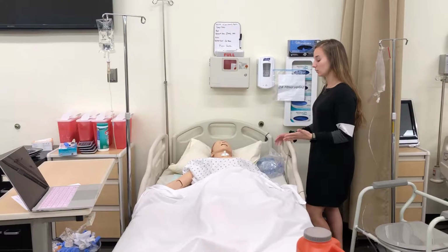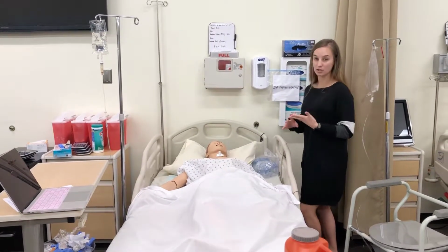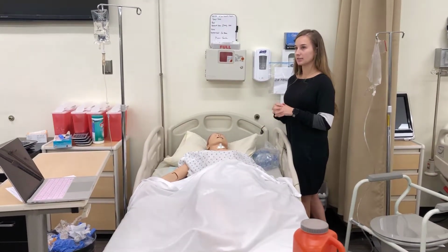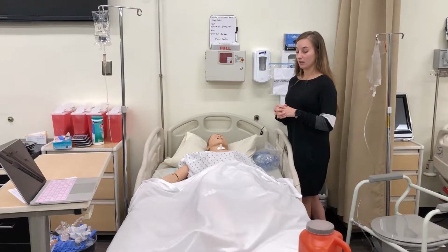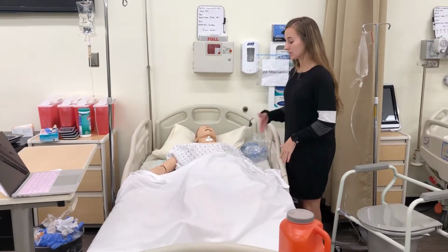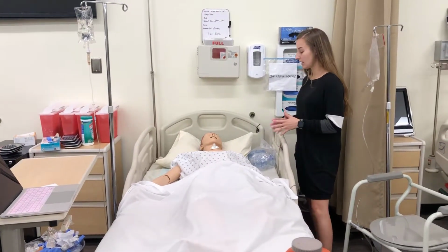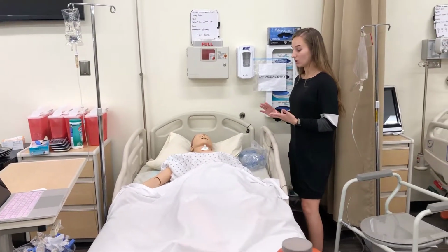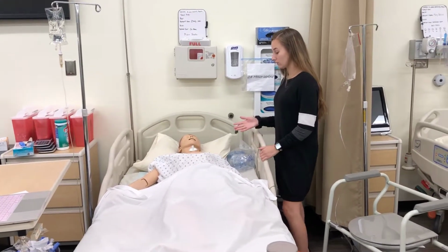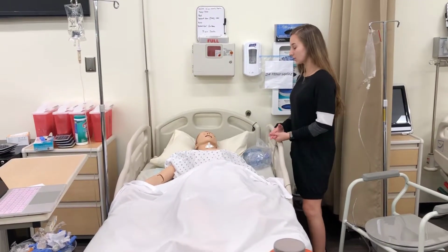Okay. Today I will be doing a 24-hour specimen collection from you, as the doctor ordered, and basically what it will measure is your glucose, your ketones, adrenocorticosteroids, and amino acids. Every time you have to go to the restroom today, we will be collecting it from a urine hat. So just let me, or use your call light button, or the nursing assistant know when you do have to go to the restroom, so we can make sure that we get all the urine within 24 hours. That sound okay?